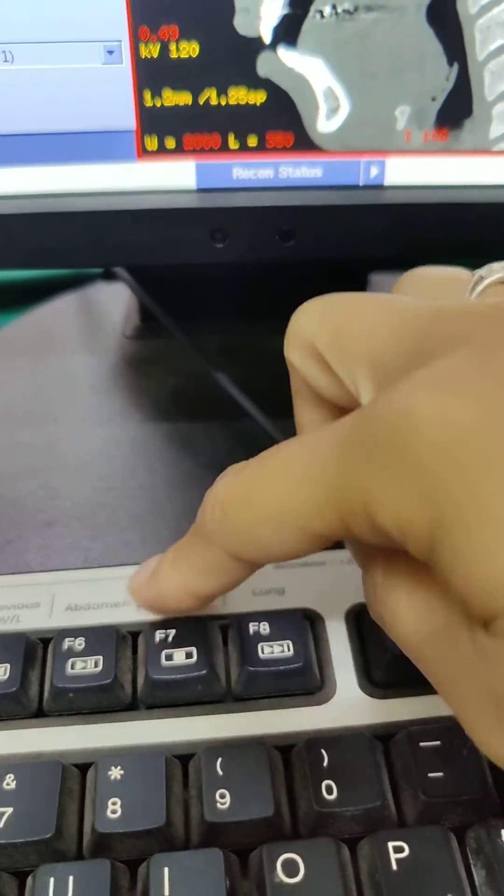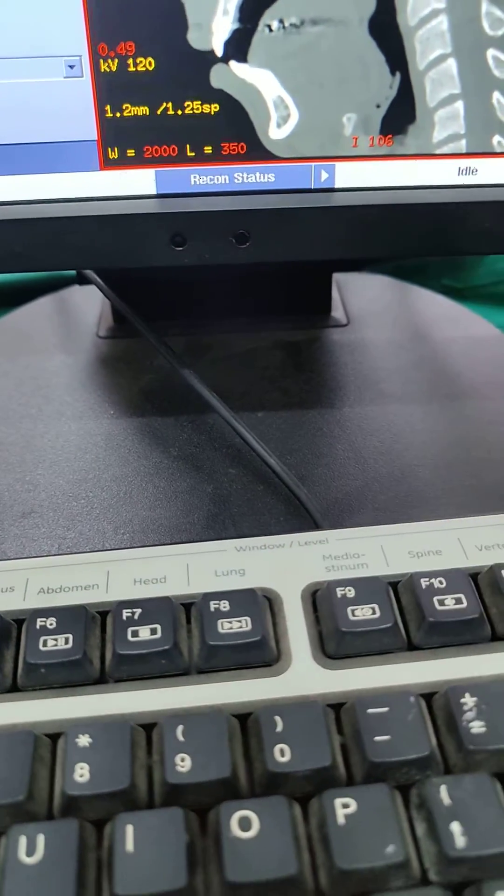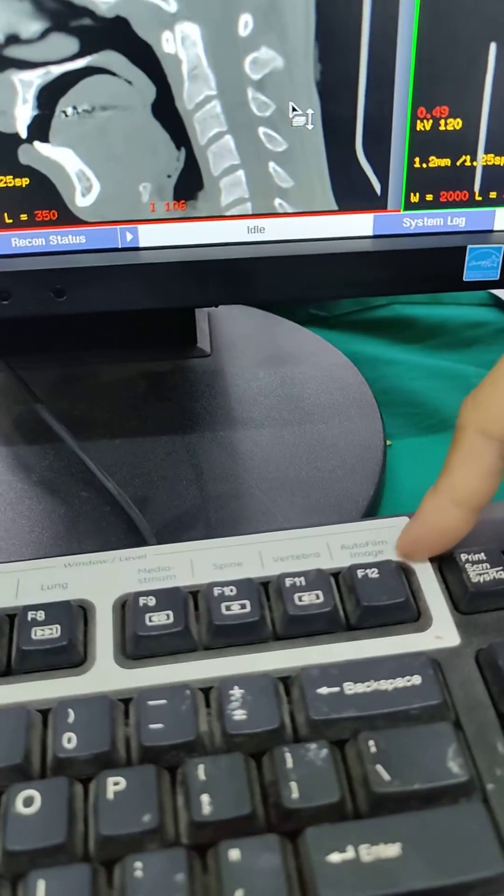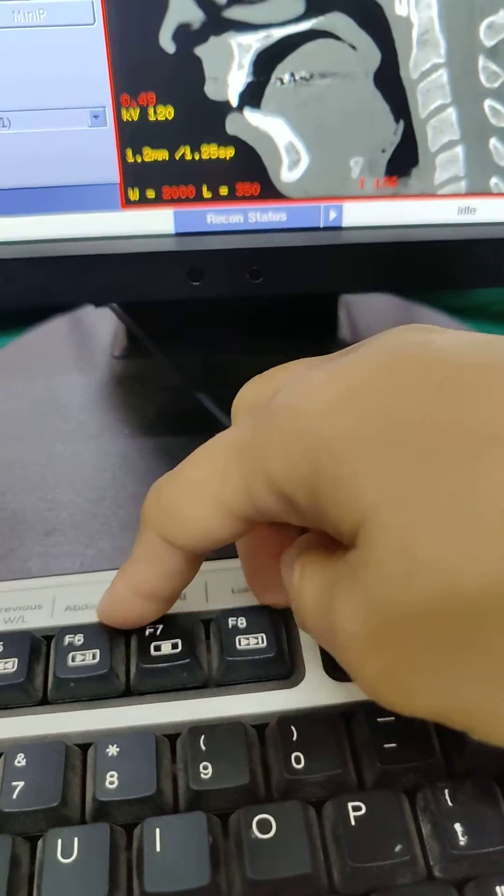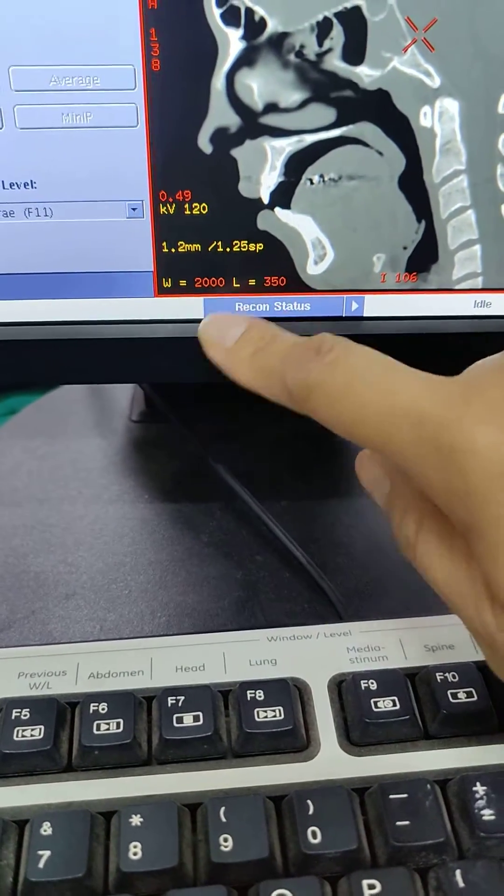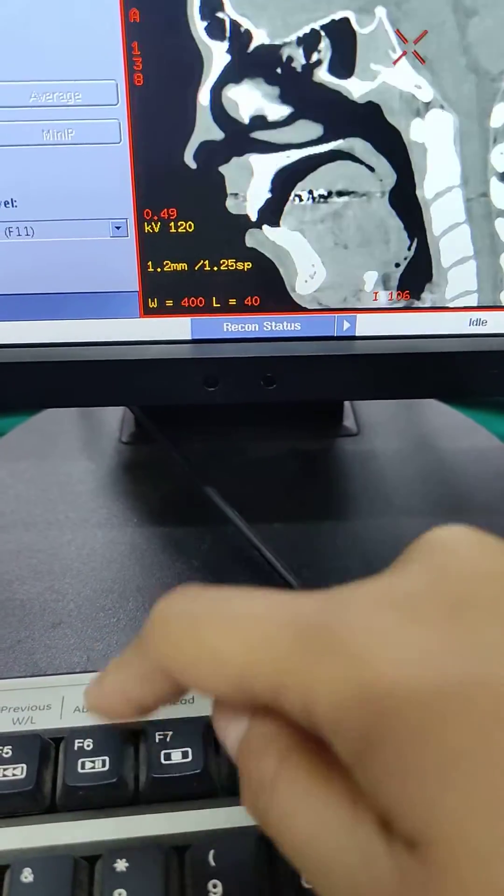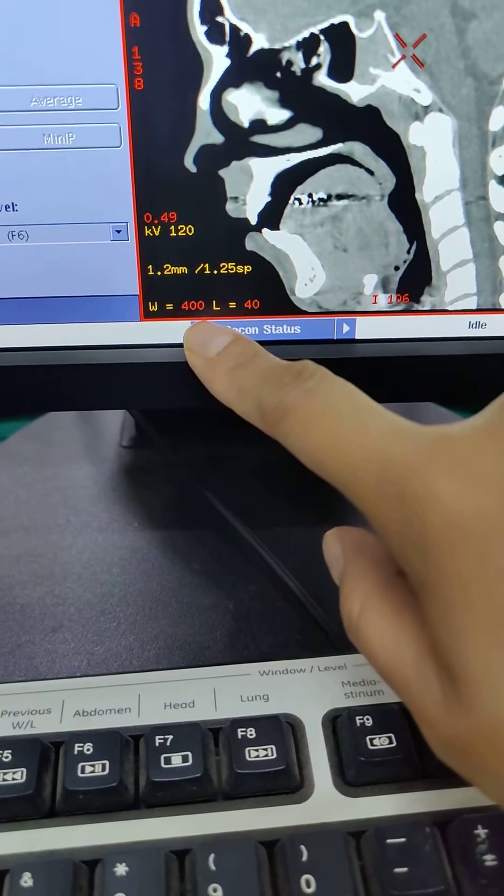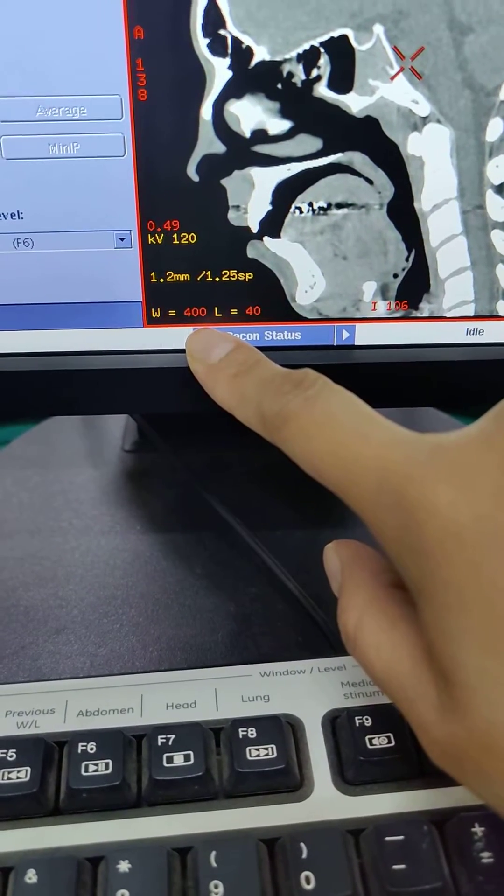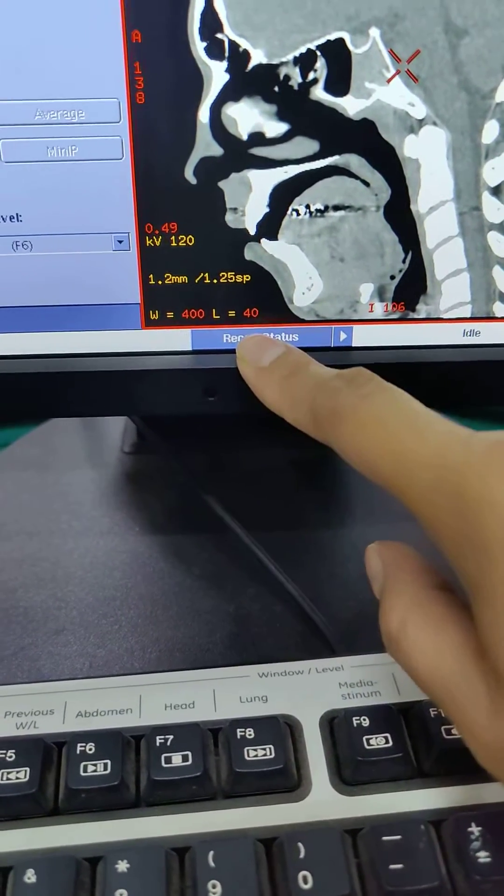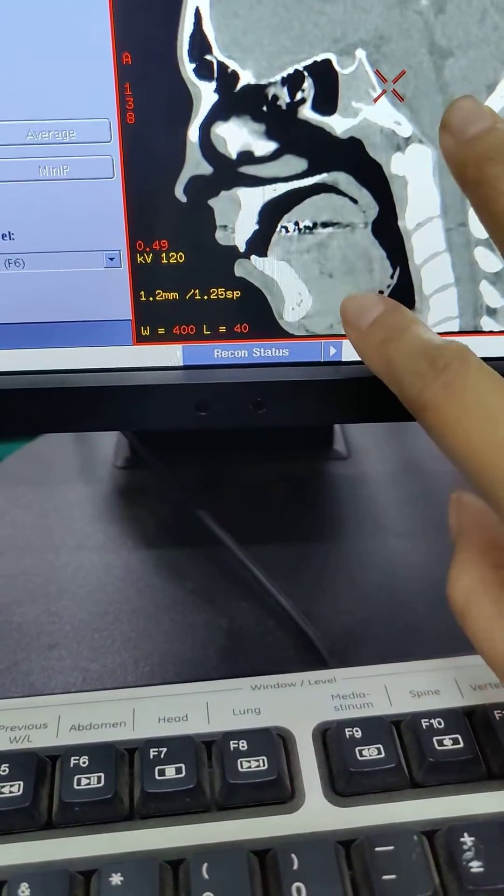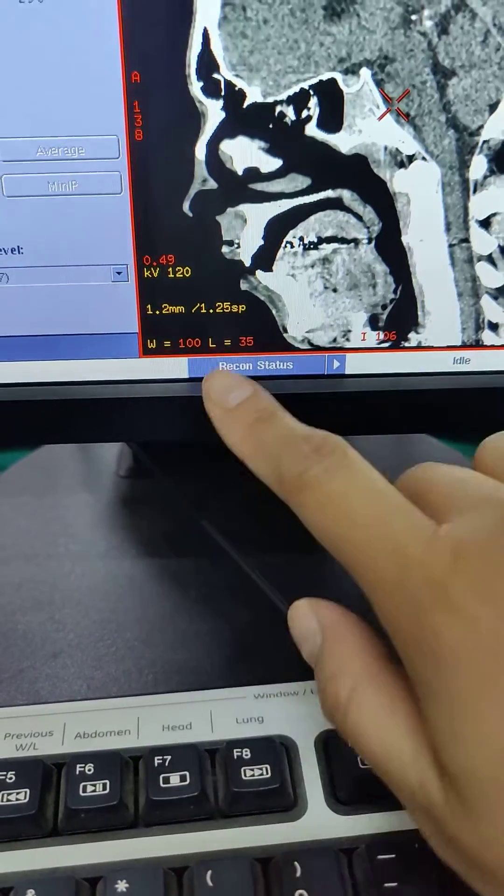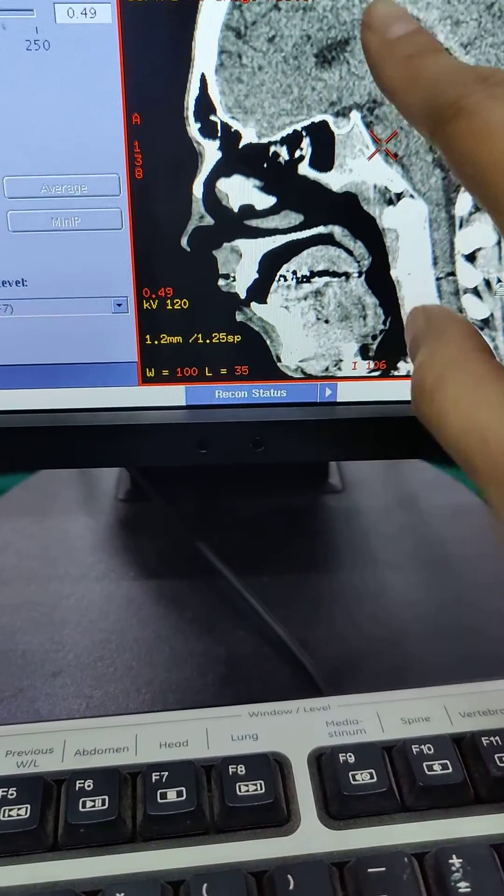On the GE, there's already preset numbers here. F6 through F11 are preset numbers and you'll see that this will change when you go through. So abdomen is going to be soft tissue, 400 window width and window level is 40. It's kind of like a grayish color. So that's why it's going to be a lower number.